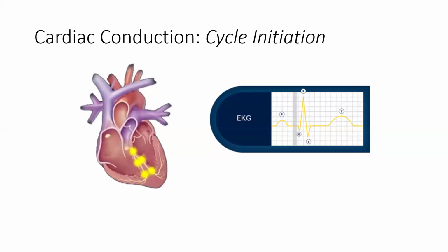Then, of course, after the atrioventricular node, it goes through the bundle of His, proceeding through the left and right bundle branches, as you can see there on the illustration. And of course, as you can see, the gray mark has moved now across that line.